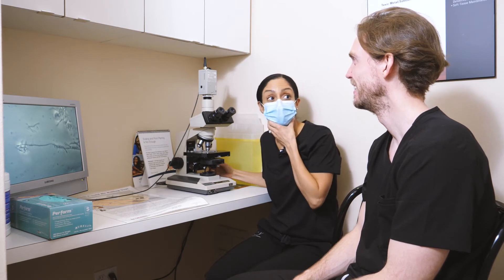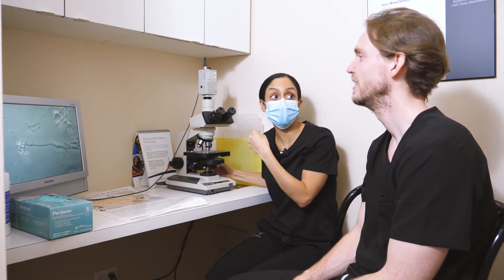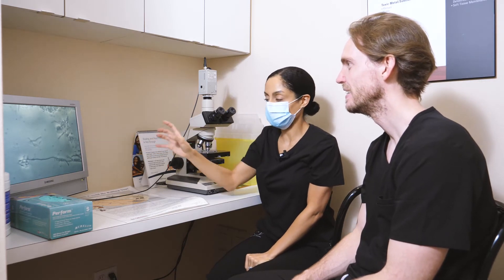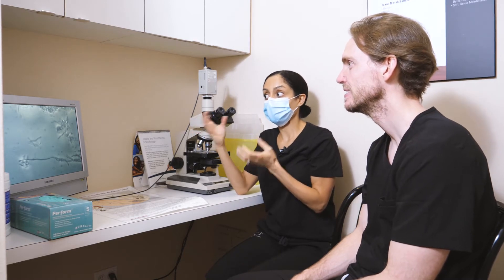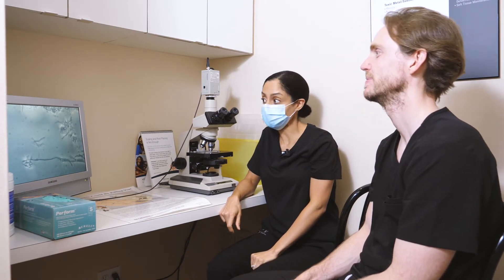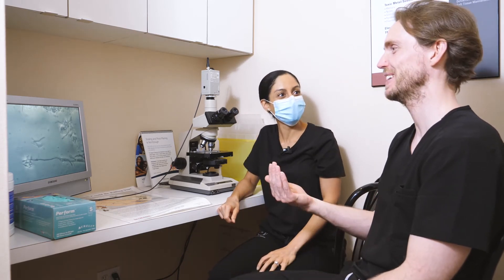We took the sample from in between your back teeth, where it's always harder to reach when you're flossing and brushing — that's an area we always tell patients to spend a little bit more time on. All these little guys that you see moving around are different types of bacteria. Any bacteria that's mobile can move around in your mouth the same way it's moving on the screen — and then into your bloodstream. Gum disease is linked to a lot of different systemic health issues, for example cardiovascular disease, diabetes, arthritis.